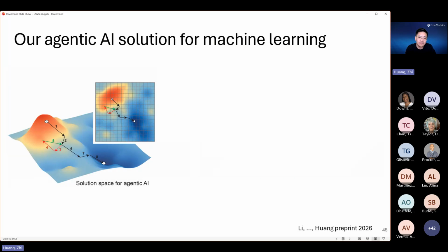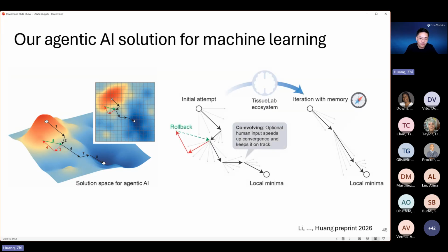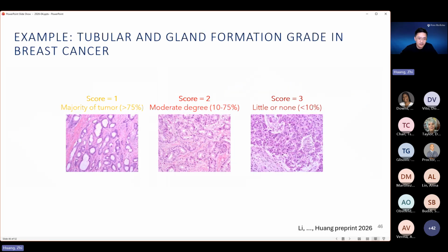So just like a gradient descent for minimizing the objective function, we start from the starting point, and at every single step, we try to find the most ideal location, the steepest descent direction, and move to the next point. Through the iteration, we'll be able to eventually find the local minimum, which is the right model combination to solve the problem. Here's an example to illustrate that idea.